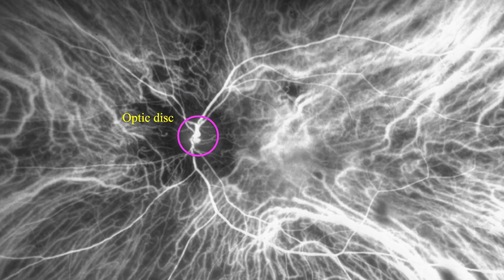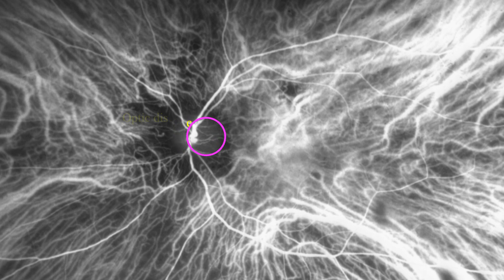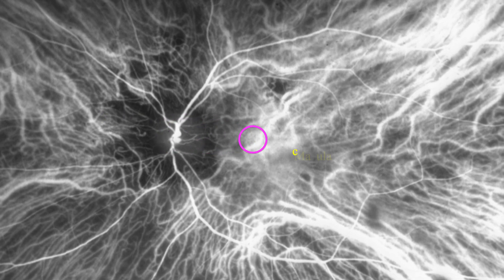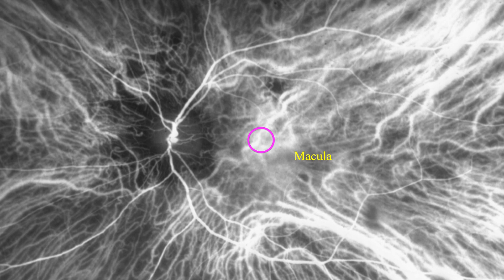Here, we can see the optic disc area highlighted. And here, the macula. Observe the important choroidal circulation that exists throughout this area, inside the temporal zone.